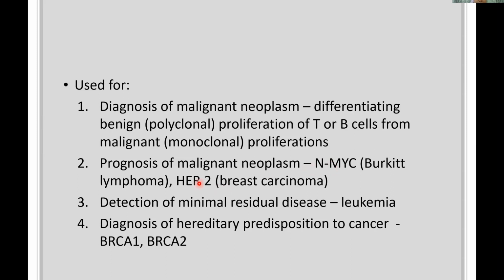Okay, for breast carcinoma, HER2. For HER2, we can do either FISH, but for ours we outsource to Pantai using the FISH. In the other center, they use the in situ, okay. Not in situ, sorry, D-dish. All right, D-dish HER2. But for ours, we use the FISH. But both techniques are established, okay. This can be done to assess the amplification of the HER2.